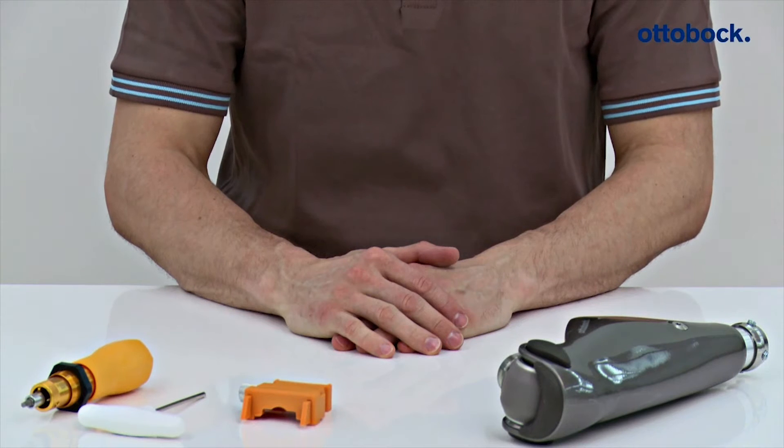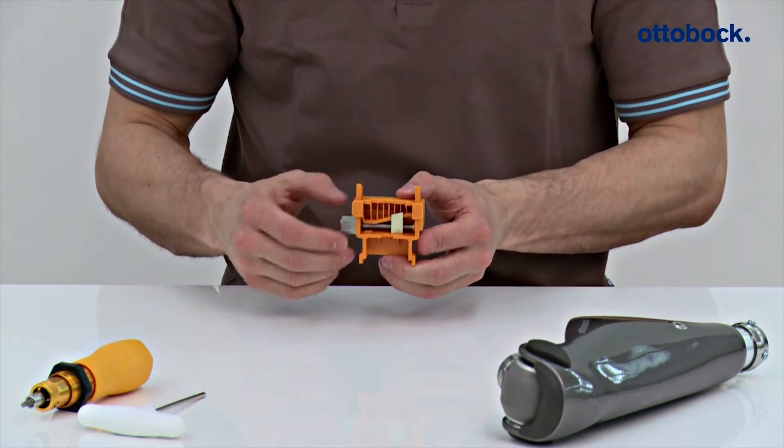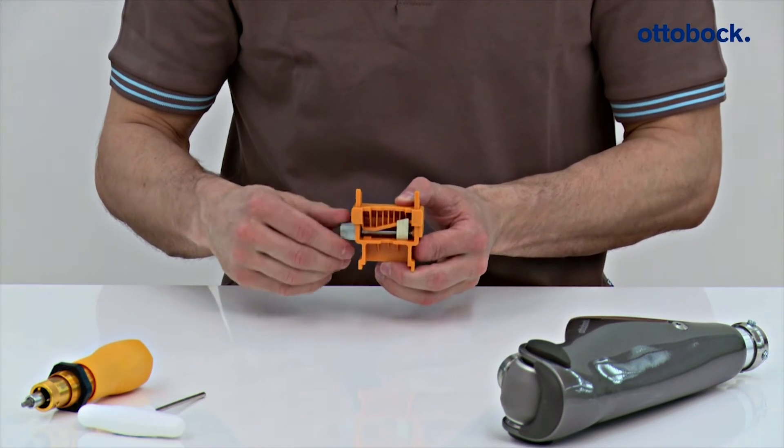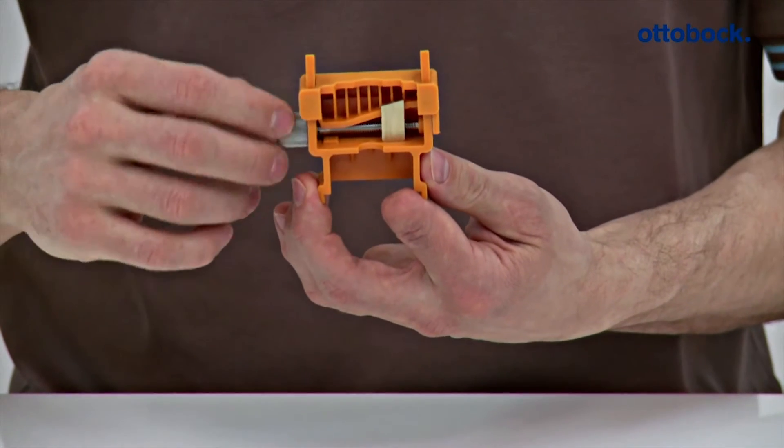The knee extender has to be used for bench alignment of the prosthesis. This ensures the recommended sagittal positioning of the prosthetic components — the foot, socket, and knee joint relative to each other — and therefore offers the full functionality of the knee joint.